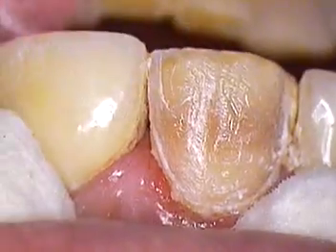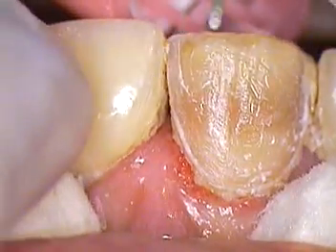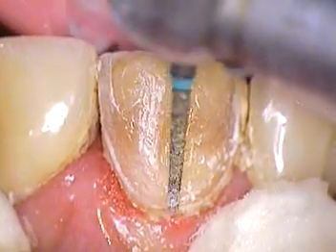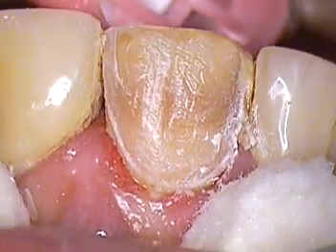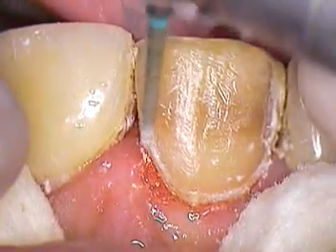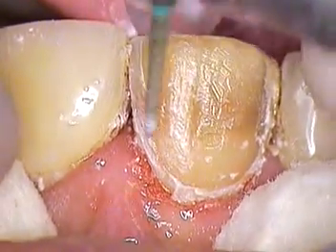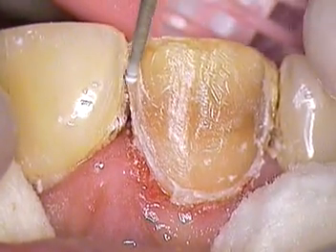Now there's some gingival inflammation related to tooth number 8 that we're documenting, from the bulkiness of the margin and its entrapment of bacteria at the neck. What we're going to have Troy do is keep him on a water pick twice a day, 2 minutes in the morning, 2 minutes at night, and get him set up for that.